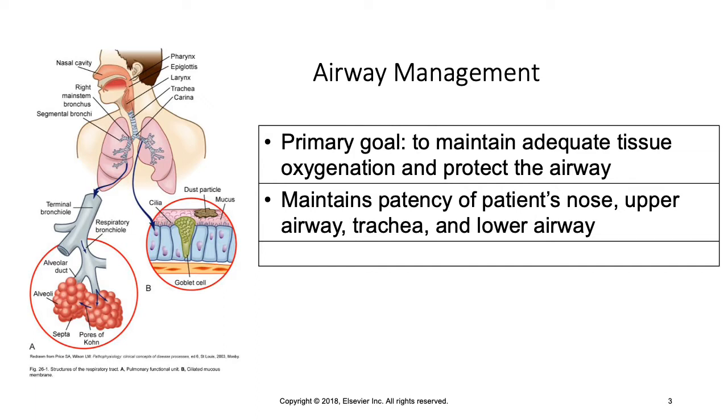So, carrying on with airway management. The goal of airway management is to maintain adequate tissue oxygenation and protect the patient's airway from food, fluids, foreign bodies, and obstruction of soft tissue. This is done by maintaining the patency of the patient's nose, the upper airway, the trachea, and the lower airways.